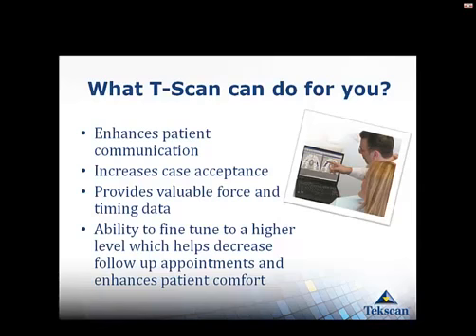So what can TScan do for you? What it does on the front end is it enhances your patient communication. There seems to be a divide between what you see as signs of occlusal instability in your patients and the patient relating either the signs that you see or their symptoms back to their bite. TScan helps bridge that divide and really allows the patient to own their own problems. And what our doctors have told us is that that helps them increase their case acceptance.